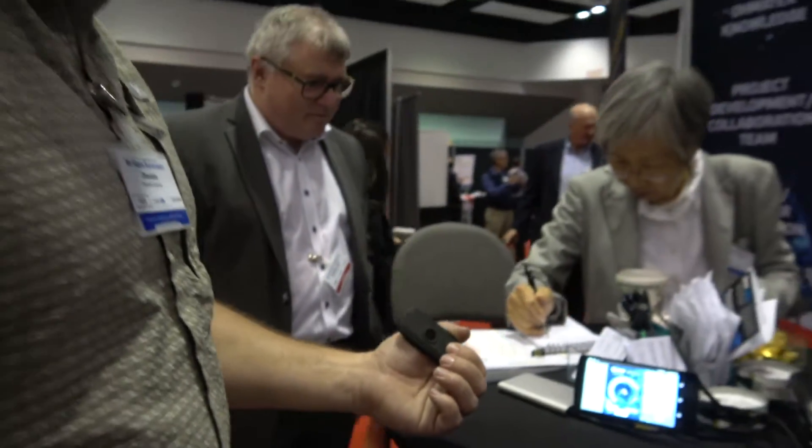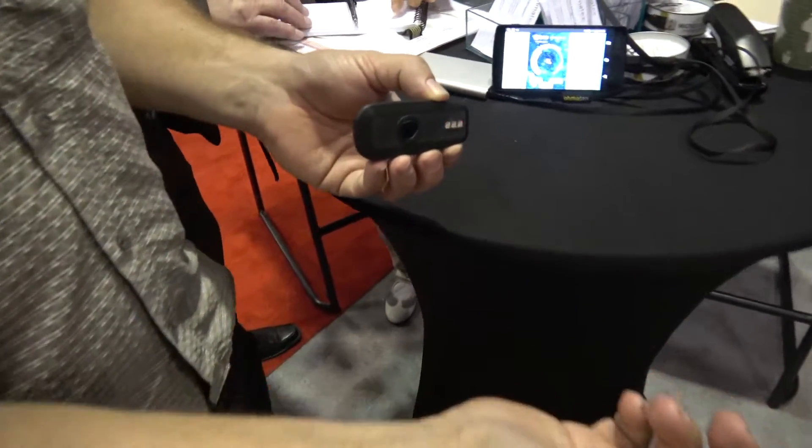We're here with Omatex. I'm Koro Johnson, an electronic engineer from Omatex. So what are you looking at here? I'm looking at the near infrared oxygen measurement of the muscle.